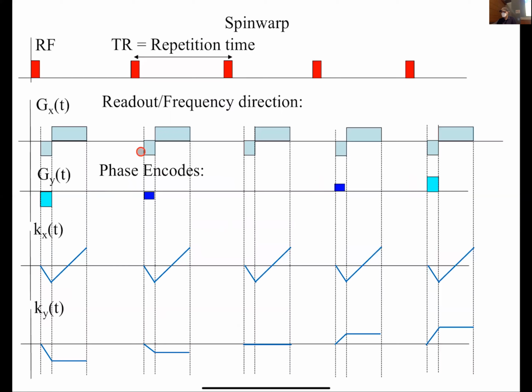So what's happening in K-space, you can see the KX transition is the same each time. It's going to negative KX max here and then zooming across to KX max. Then once again going down to minus KX max and going up to KX max. So it's a linear progression across KX space. Here, the KY has a different job. It takes you out to some initial position and then just holds it. Then another initial position and just holds it. So that's the offset in the KY dimension.